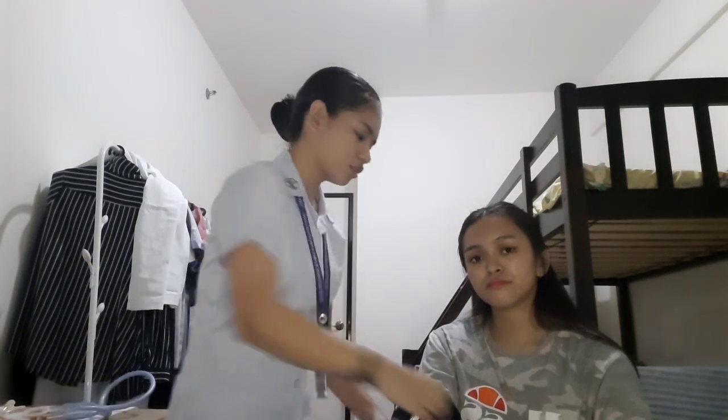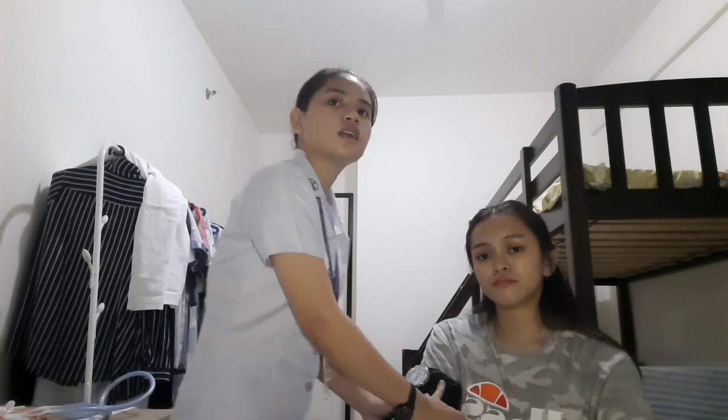And I will deflate the cuff. Release the valve on the cuff carefully so that the pressure decreases at the rate of 2 to 3 millimeters of mercury per second. As the pressure falls, identify the manometer reading at Korotkoff phase 1, the systolic BP, the first tapping sound heard during deflation of the cuff.